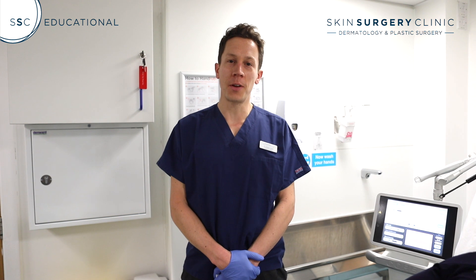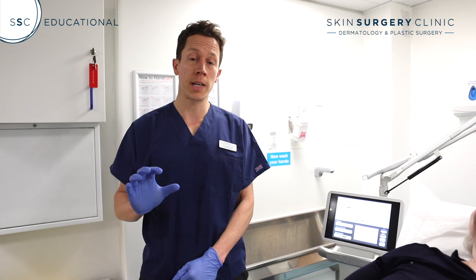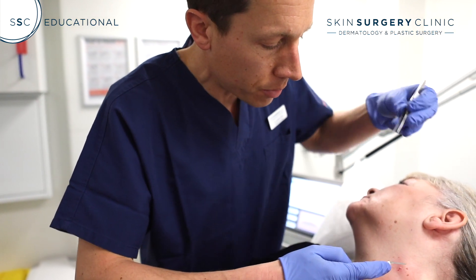My name is Dr. Andrew Smith, I'm one of the doctors on the medical team here at the Skin Surgery Clinic. Today I'm going to demonstrate using a machine called the Hyfricator, which is extremely useful at removing multiple small skin tags. I'm just going to demonstrate the removal of two or three of these smaller skin tags that Debbie's got with the Hyfricator.